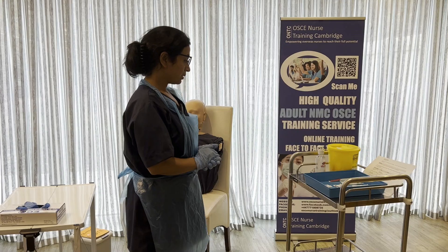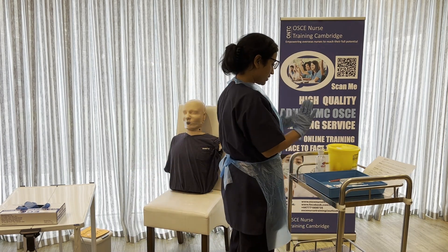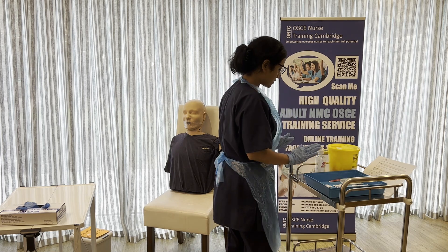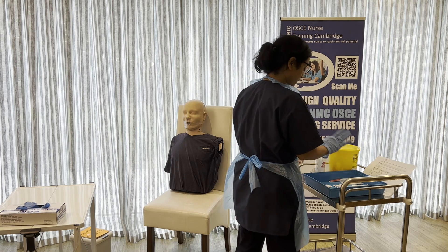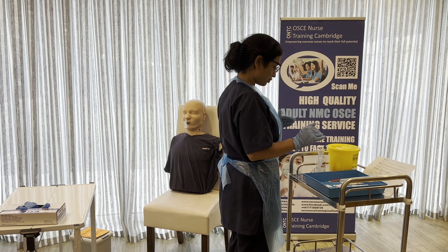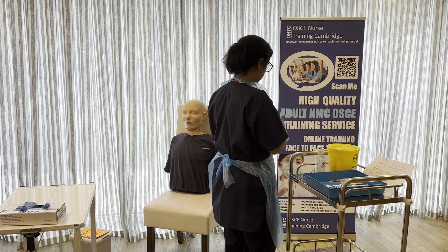I'll now show you the clip on how to draw up the injection without using the re-scoop method. My gloves and apron are on. I've already done the ID check, allergy check, checked my medication and all consumables, confirmed the validity of the prescription, and checked the drug expiry date against the prescribed drug. Now I'll show you how to draw up according to the new marking criteria and give the injection.